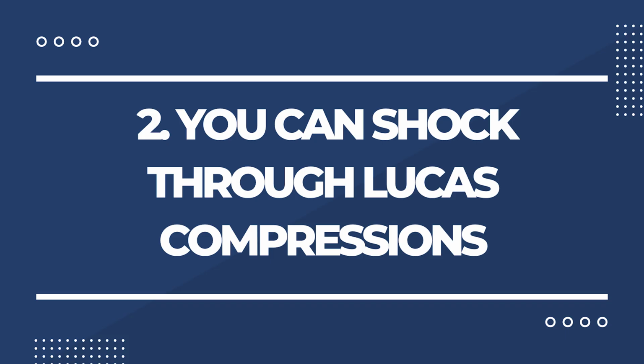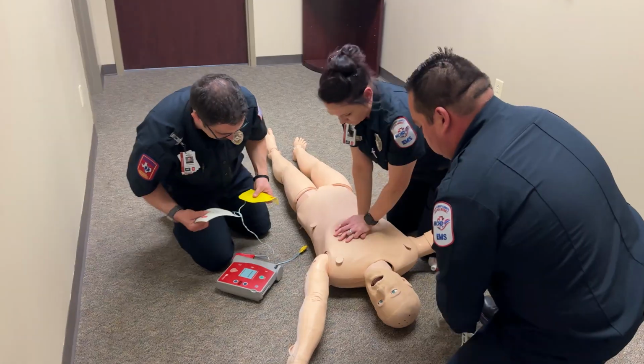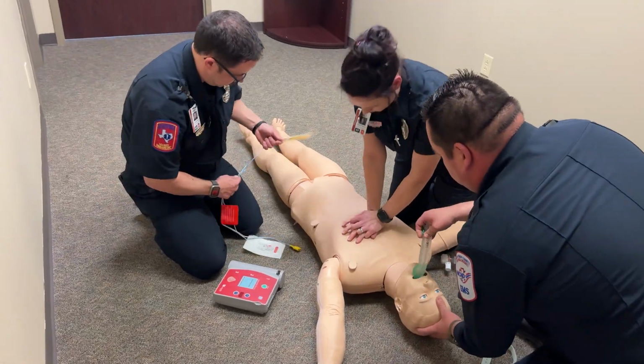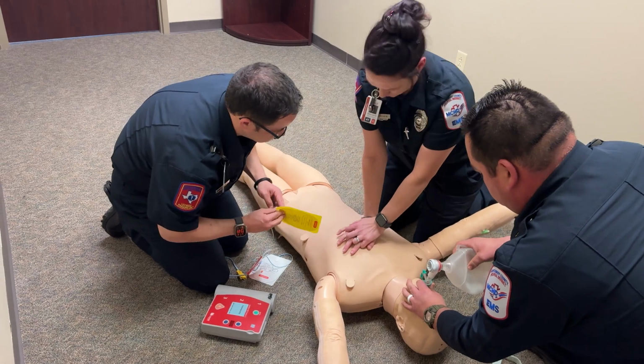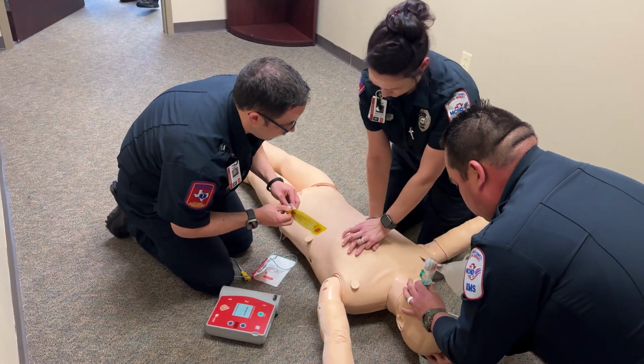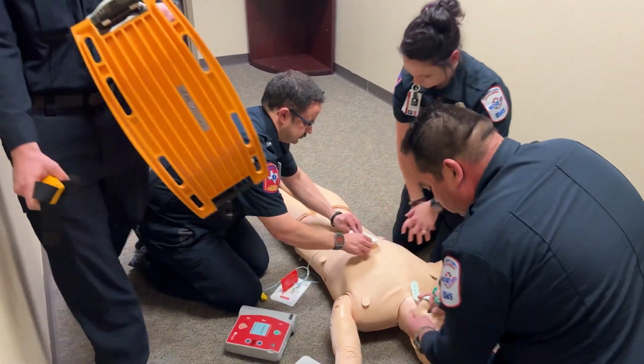The entire package here is to minimize our pause times, because if we are prolonging pause times by placing the Lucas device, we're putting the patients at risk, we're decreasing their chance of neuro-intact survival. So timed, communicated, teamwork, pause minimization is the key.